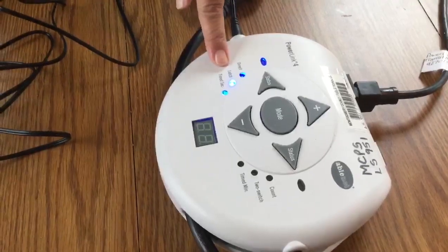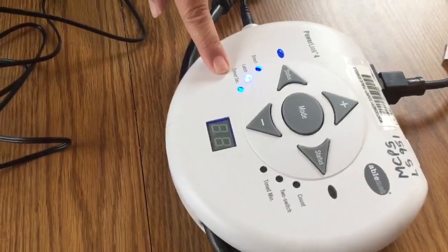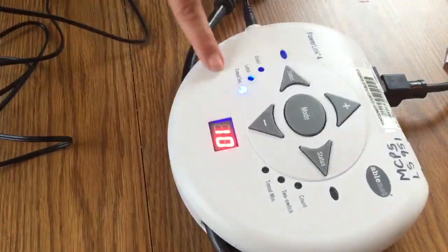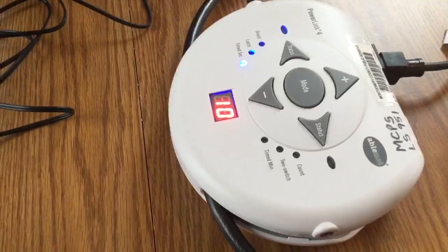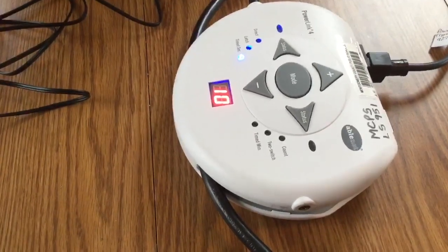Now it's set to the latch setting, but for this toy I want to have it work on timed seconds. To change it, I push the mode button. Now it's on timed seconds. I have it set for 10 seconds. That means that when we activate the step-by-step, the toy will play for 10 seconds and then turn off.